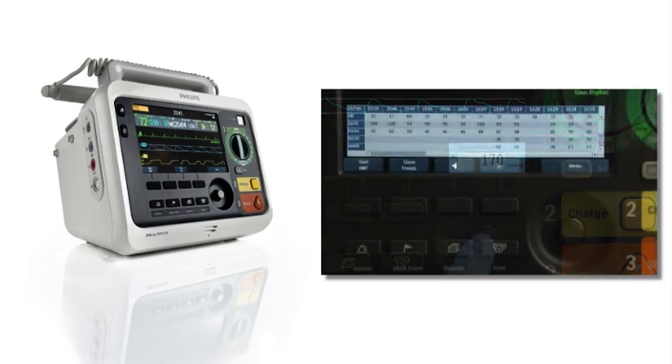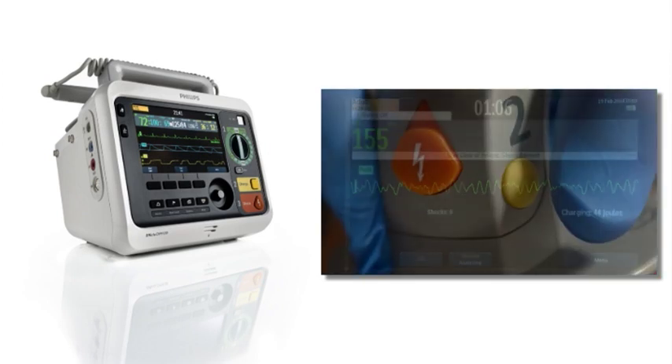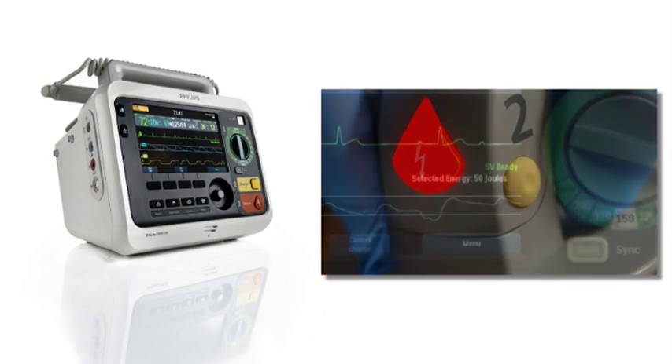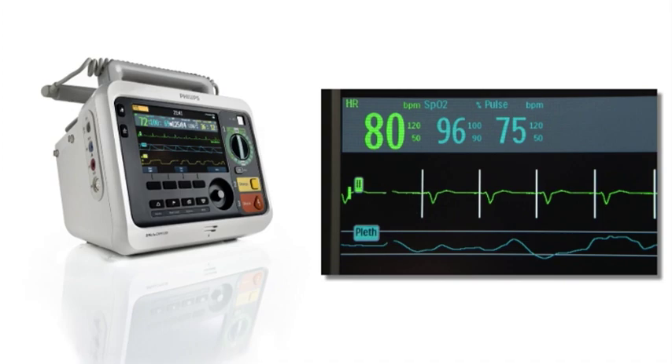We'll also display trending data, demonstrate AED and manual defibrillation, sync cardioversion, and pacing therapy.